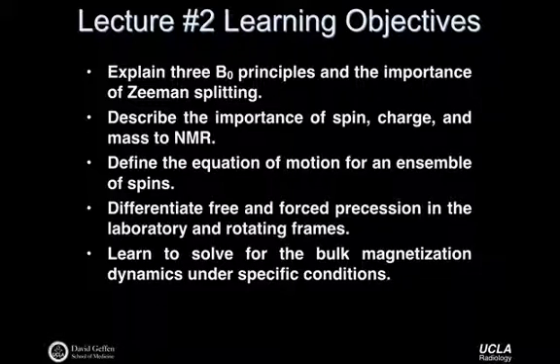So I would say it differently. The free precession is what happens when we're not acting on the spin system, right? It's been acted upon previously, maybe by an RF pulse, maybe by gradients, maybe by something else. But it's the behavior of the spin system just in the presence of B0. They're just free to do what they do. Relax, spin, whatever. We haven't talked about relaxation. That's coming next time.